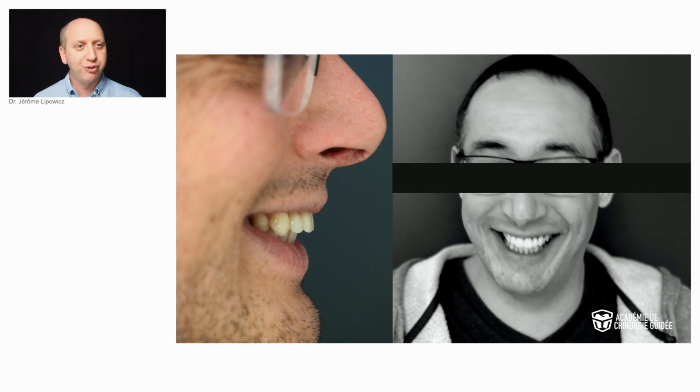And I was lucky enough that the patient wanted to keep his overjet and the lip position, so it couldn't be a better situation for an immediate loading from an occlusion point of view.